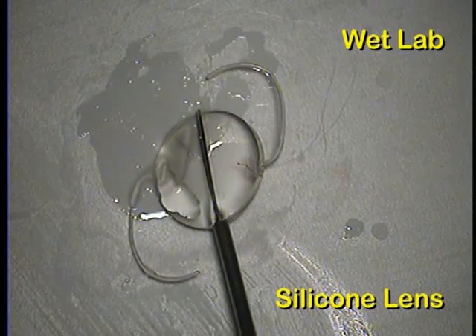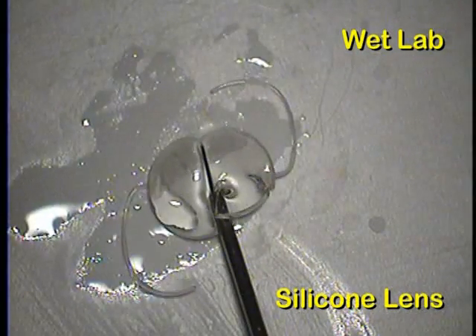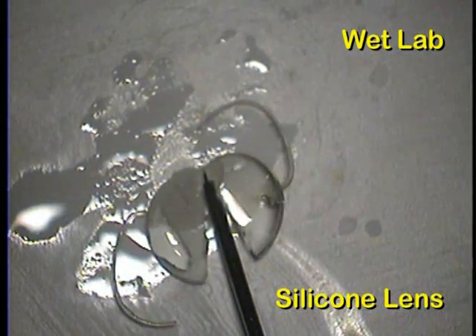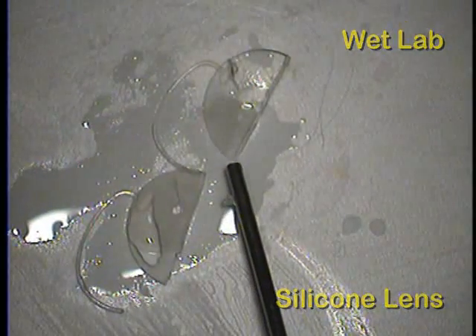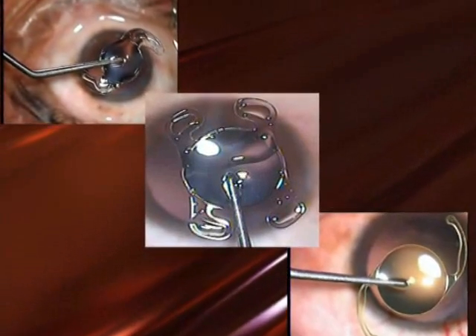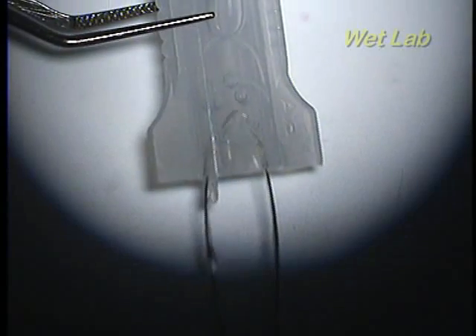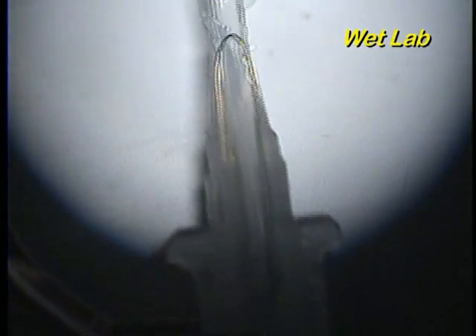To our surprise, the silicone lenses could be cut effortlessly, as if a knife through butter. So we tried the snare technique for the hydrophobic and hydrophilic single-piece lenses for their explantation as well.